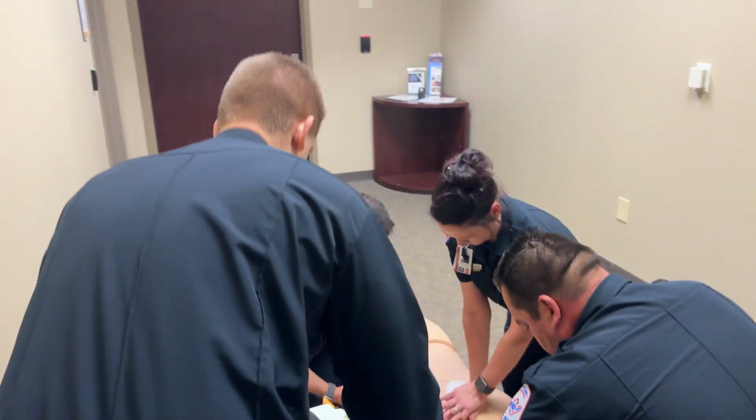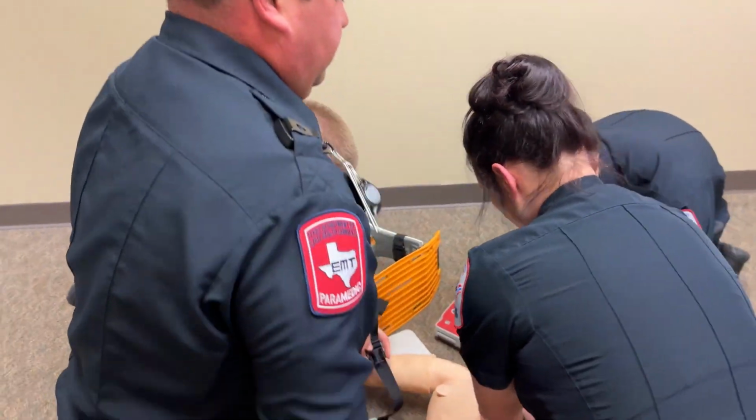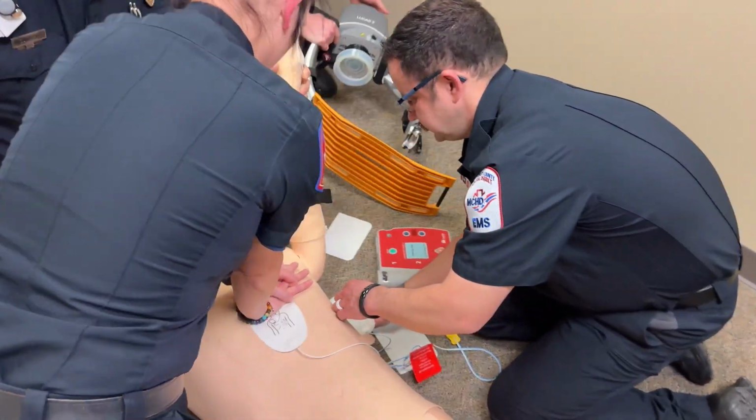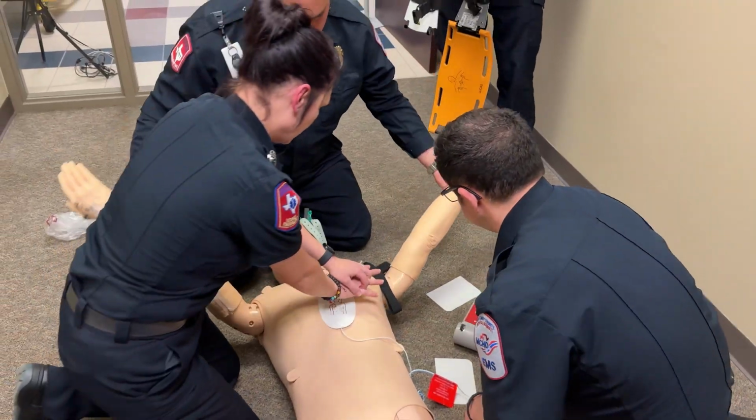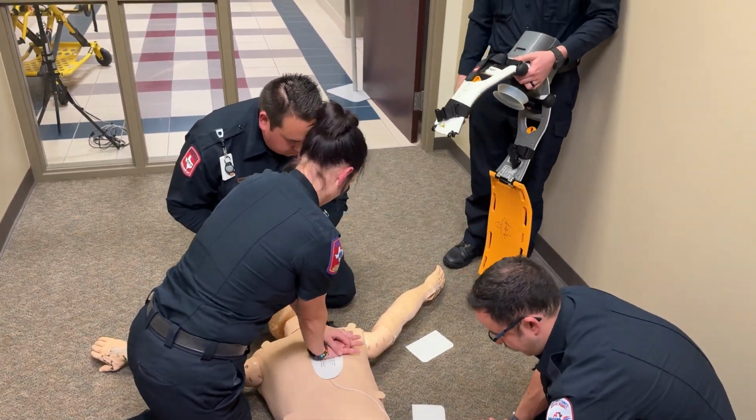When you change someone doing CPR compressions manually on a scene, there's no device to clip, there's no planning. Firefighter A has to back up while paramedic B resumes compressions. That's a pretty easy process.